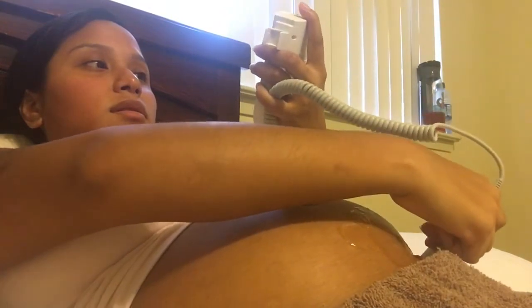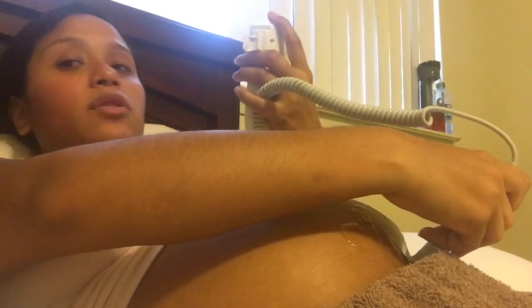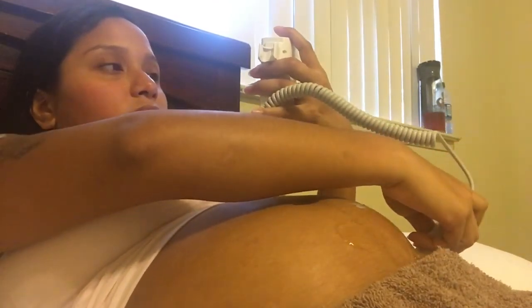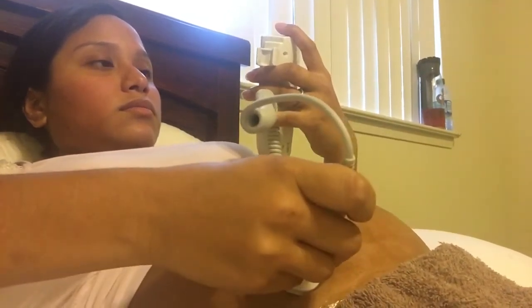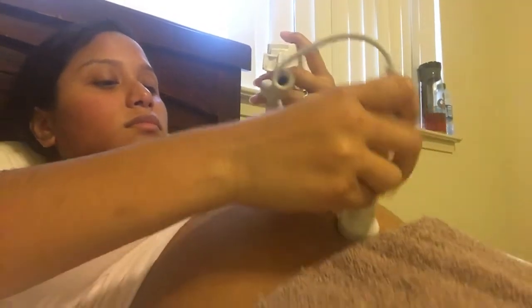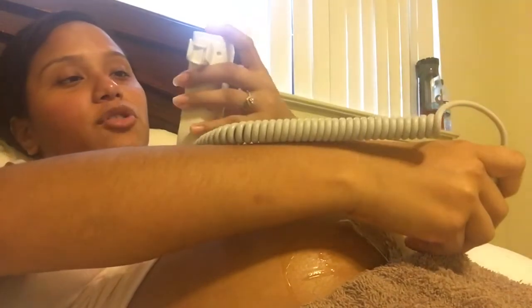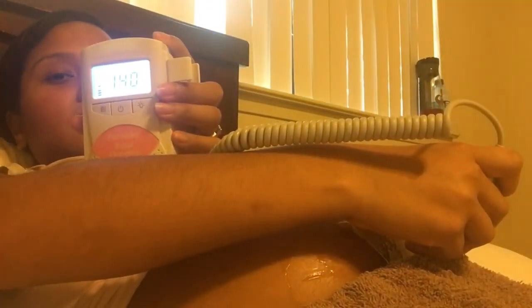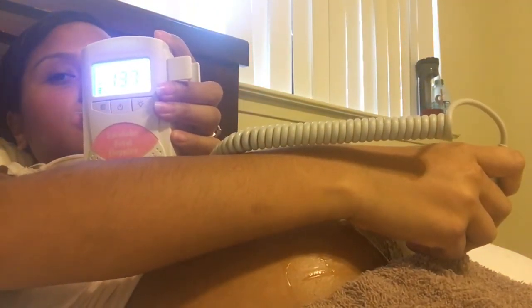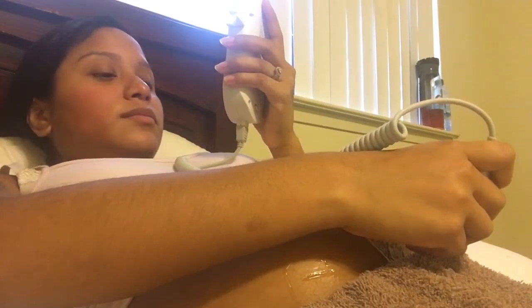I'm going to show you guys what her heartbeat sounds like versus what's not her heartbeat. There's like blood flow sounds, but that's her heartbeat — that's the stronger one. I'm going to show you what's not her heartbeat. She has like a horsey heartbeat sound. She's moving!